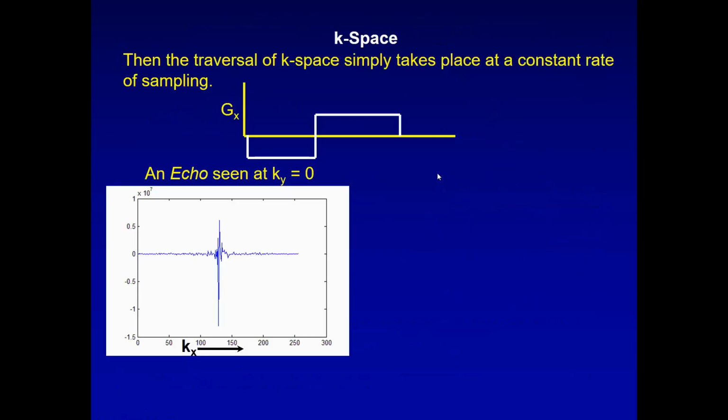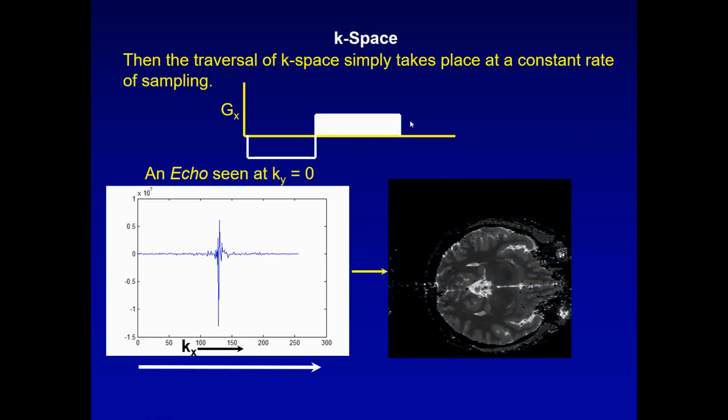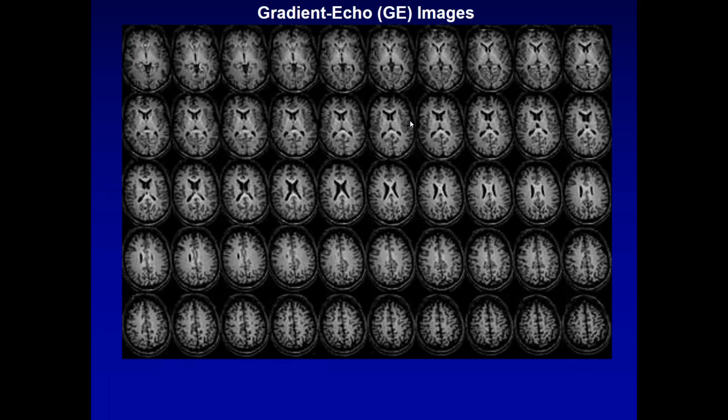Okay, so here K-space is sampled at a constant rate after we do this read rephase. Here's the read gradient. That's the read prephase. There's the read rephase. If we get both dimensions of XY, we can get a full image.